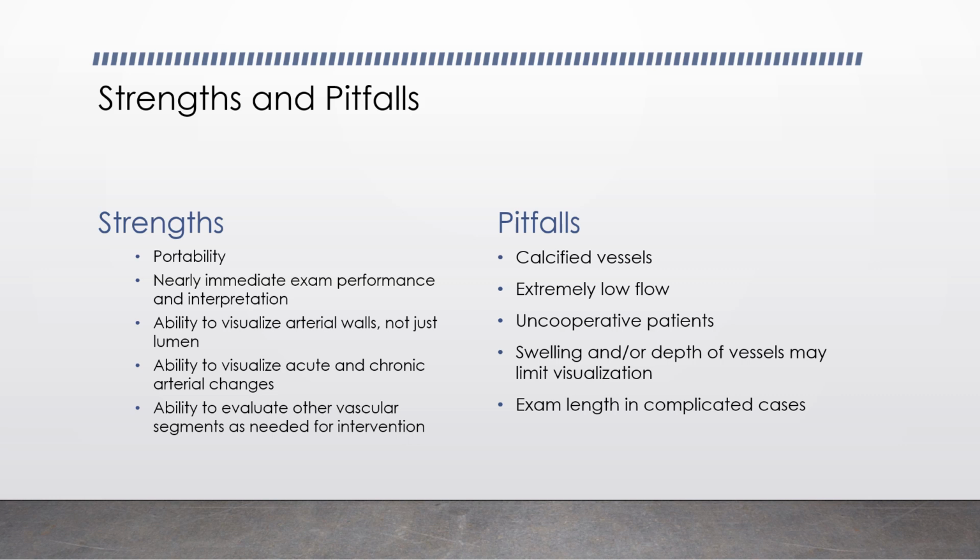Okay, the strengths and pitfalls of these exams. One of the strengths is that it's portable. Even if a patient's in bad shape, we can take it to their ICU or wherever they need the exam done. Usually by the time the technologist has completed the exam, they have almost immediate assessment of that exam, and so the physician should be able to report on it almost immediately.